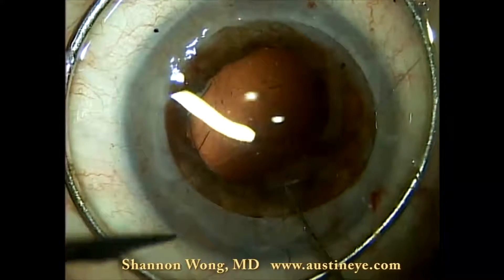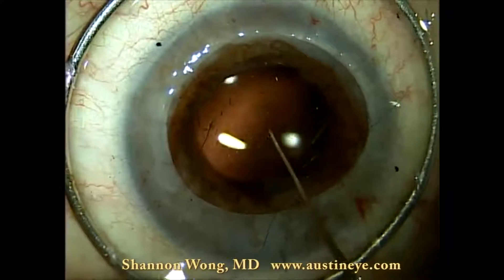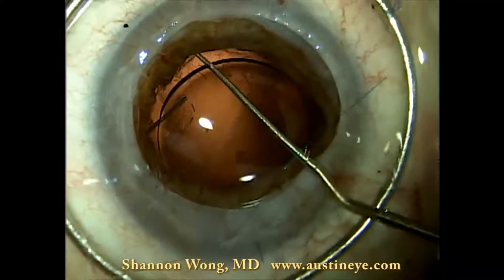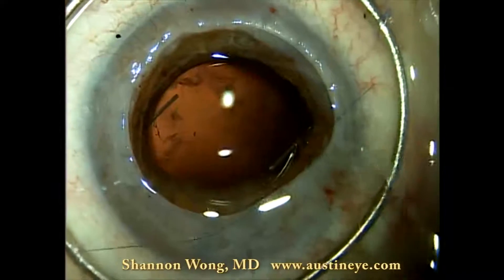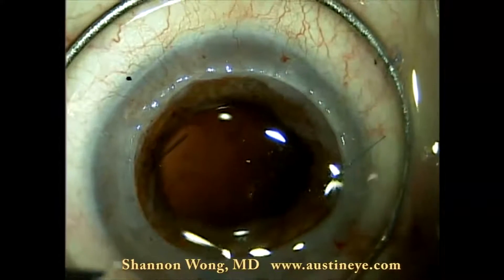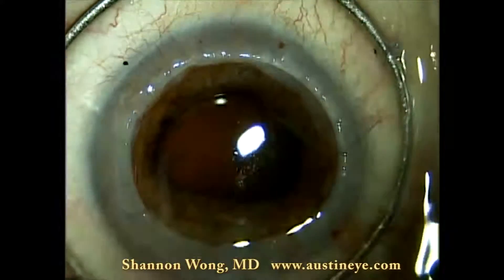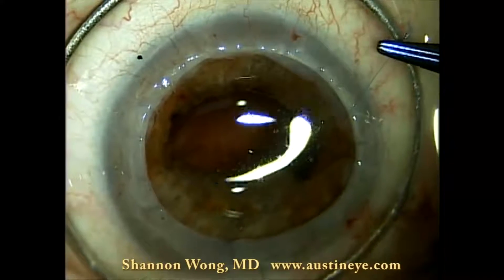Now we've made it 360 degrees around and we tighten the suture, but we have one restriction. We want to prolapse the optic anterior to the iris plane to stabilize the IOL while we suture it to the iris. However, knowing we're going to have to prolapse the optic posterior to the iris plane afterward, I can only tighten the suture and decrease the pupillary opening by so much — because if I over-tighten it, I'll have difficulty prolapsing the lens optic back into the posterior chamber.